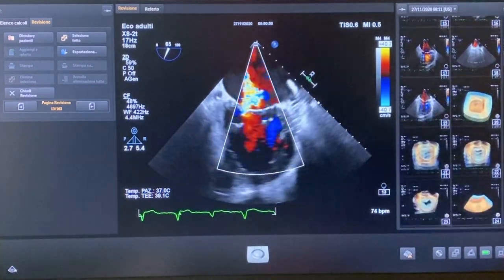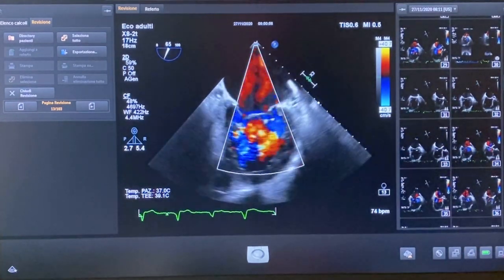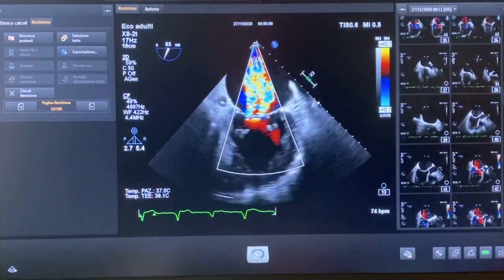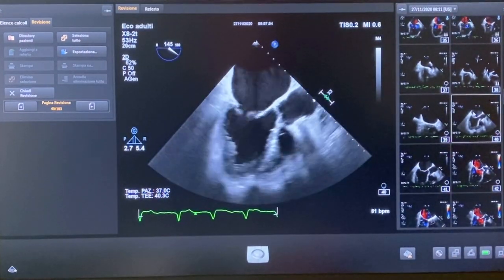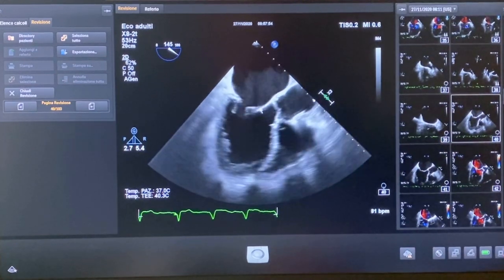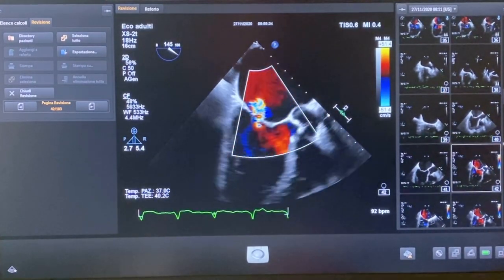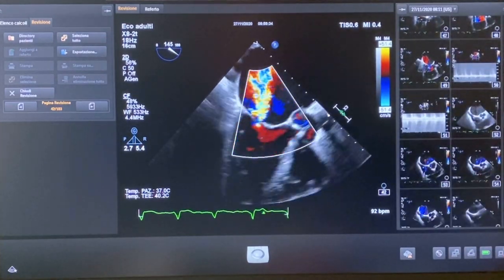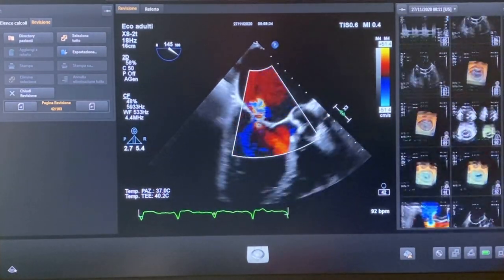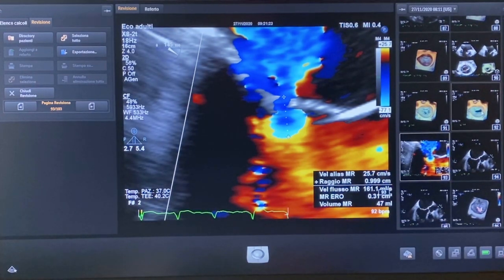Then we go to the 90 degree view. We can put the 3D on here, but we will look at that later. We go to the three-chamber view in which we can see P2, A2, and the aortic valve as well. We can see the annulus, the leaflet, and the subvalvular apparatus. We then put the color on and perform all the measurements — for example, if the patient could be a candidate for the mitral clip — including the PISA values and above all the 3D evaluation.